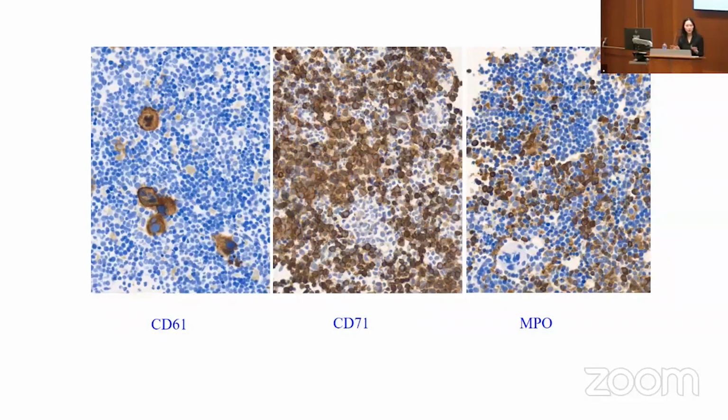Here are our immunostains. I won't go into detail about how immunostains are done because it's quite complex, but essentially the large picture of it is they're antibodies to antigens on the cell surface that identify the cell and also can be targets for treatment because the cell is expressing these antigens. The antibodies that we have are all conjugated to a brown stain when you look at it in light microscopy. So you might say, wow, they're all brown. How do you know what is what?